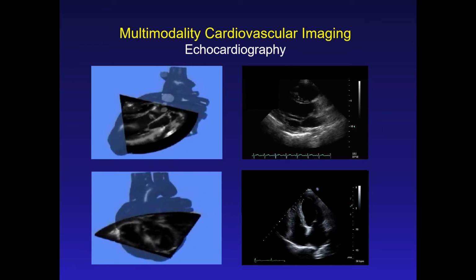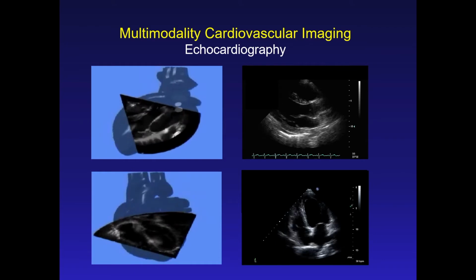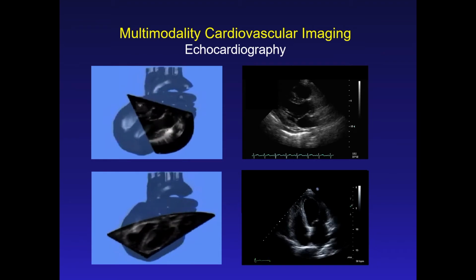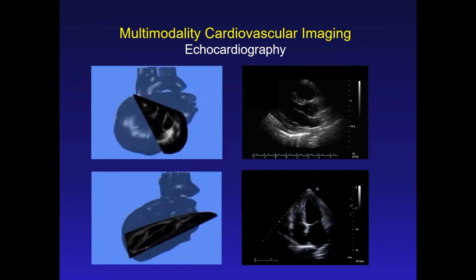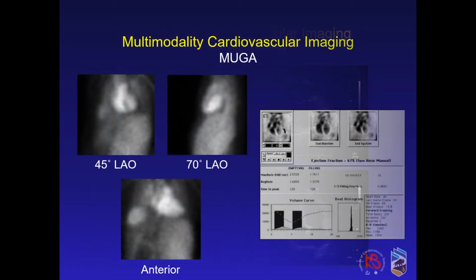With respect to echocardiography, this continues to be the workhorse of imaging in 2020. Non-invasively one can clearly identify the LV systolic diastolic function, whether there are valvular abnormalities in the patient, as well as pericardial disease, all in one limited study. With respect to MUGA scans, they are very useful in the provision of accurate LV ejection fraction values, in particular in individuals that are receiving anthracycline-based chemotherapy in the cardio-oncology realm. However, in the setting of apical cardiomyopathies, MUGA scans have limited use.